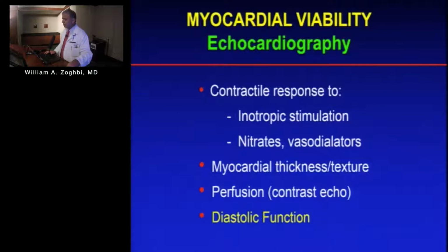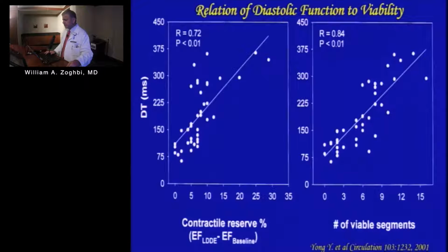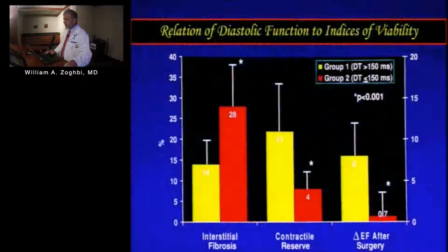And last but not least, we look at this, we don't quantitate it, but I think it's important for you to keep that in mind, although diastolic function is very load dependent. Interestingly enough, we had some experience with comparing our diastolic parameters with biopsies in patients undergoing revascularization, and it tells you a few things. If you have this slow relaxation pattern where you have low E, high A, and therefore longer deceleration time, it is in a way an indicator for myocardial viability.